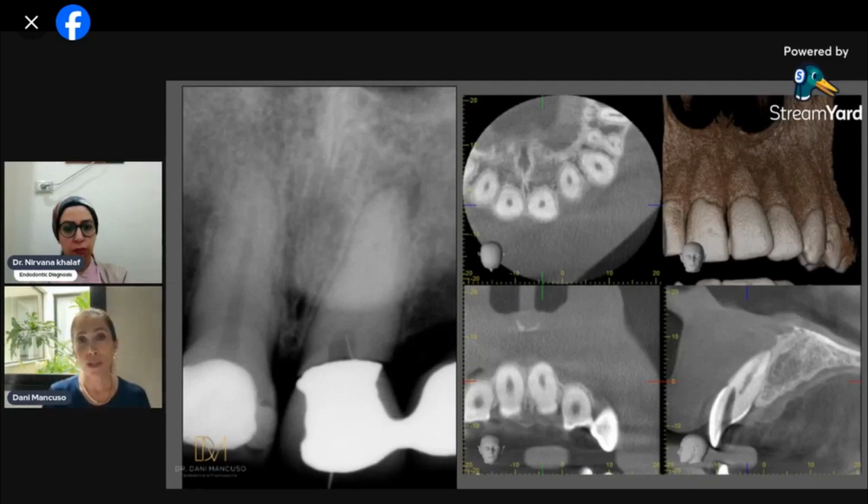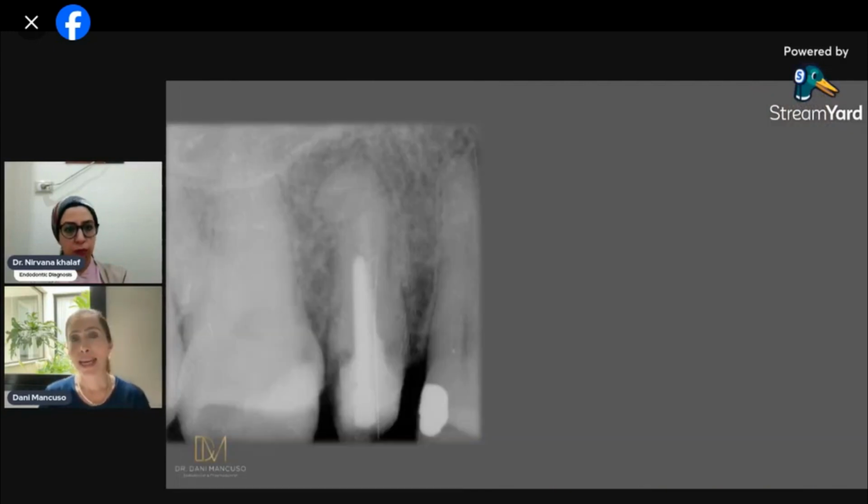So in this case, when you take the scan, you can see exactly where the canal is, and it's a lot easier for you to correct at that time before you perforate. A case that, again, you need to get the patient on board and everything needs to be quite good for you to plan your case.